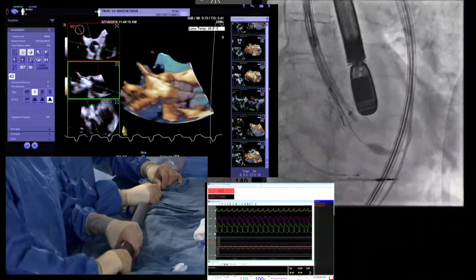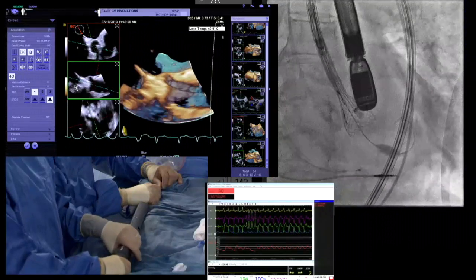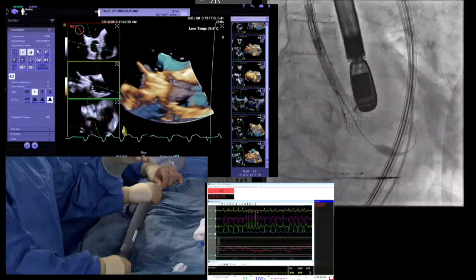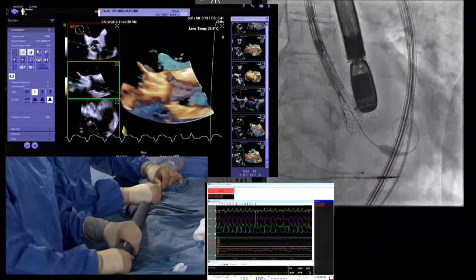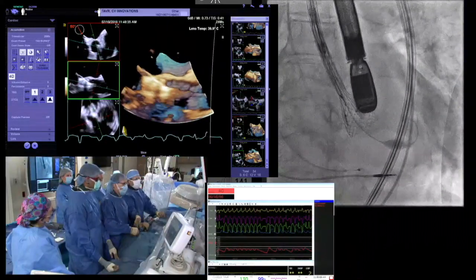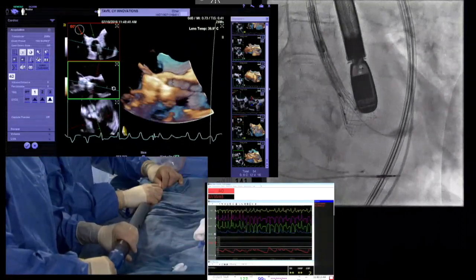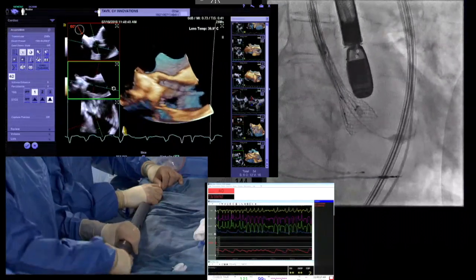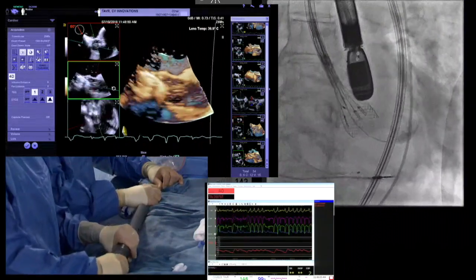I do. Pull back, Bob. There you go. So as he's doing this, I'm pulling back. Pace a little faster. We're pacing at 110 right now. So what I'm looking for is the symmetry of the braid density as it's coming out. So far, it doesn't look like a banana-shaped deployment. Everything looks really good in terms of the density of our braid, et cetera. So I kind of like what we're doing here, getting a little bit more ectopy. I think that's just our wire. And by the way, the valve has been functional since we were about 20, not attached to anything.